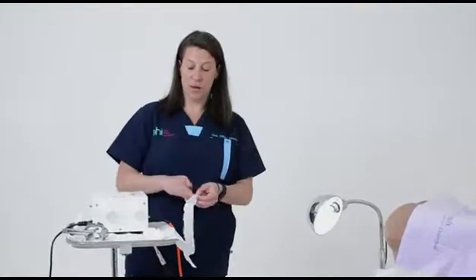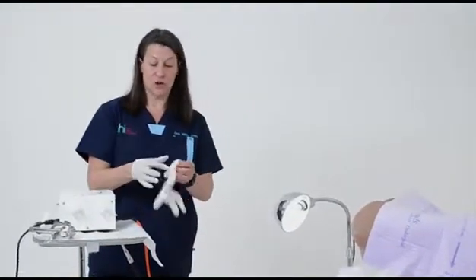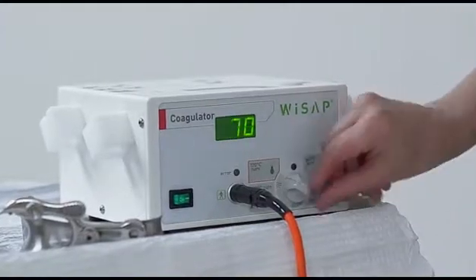It just connects in the back to turn on the machine. Next, you get your patient ready for the procedure. The machine gets turned on by the little button in the front, and you can turn it up to 100 degrees.